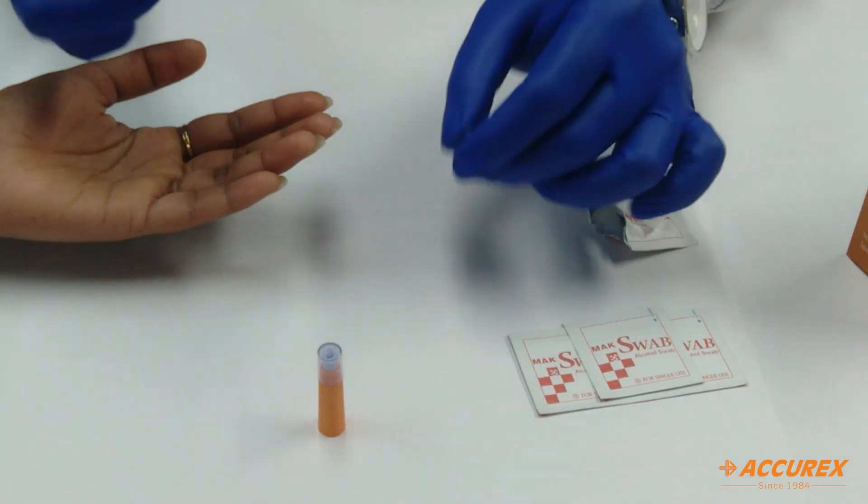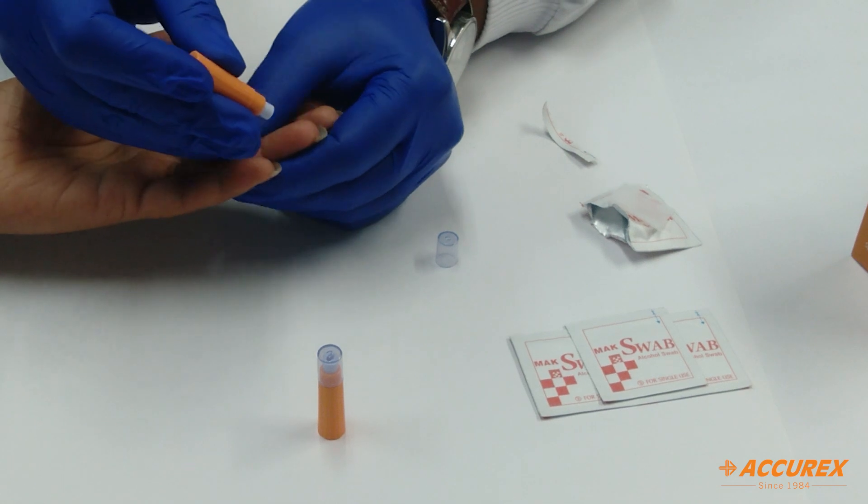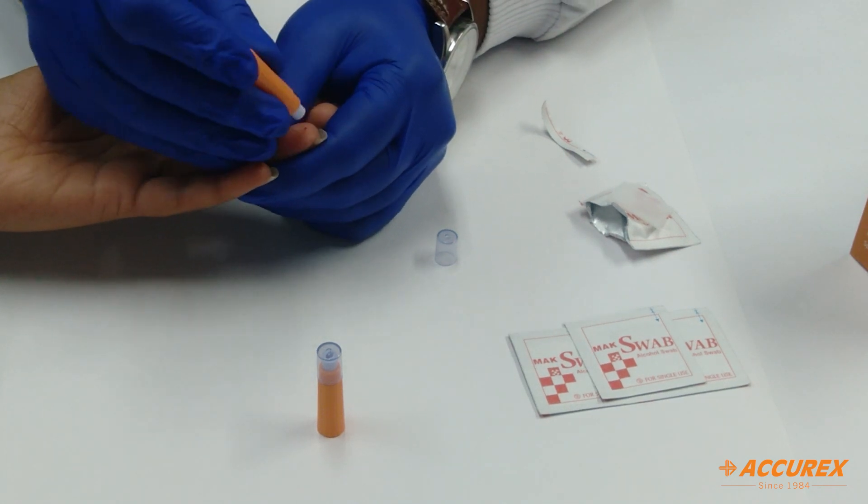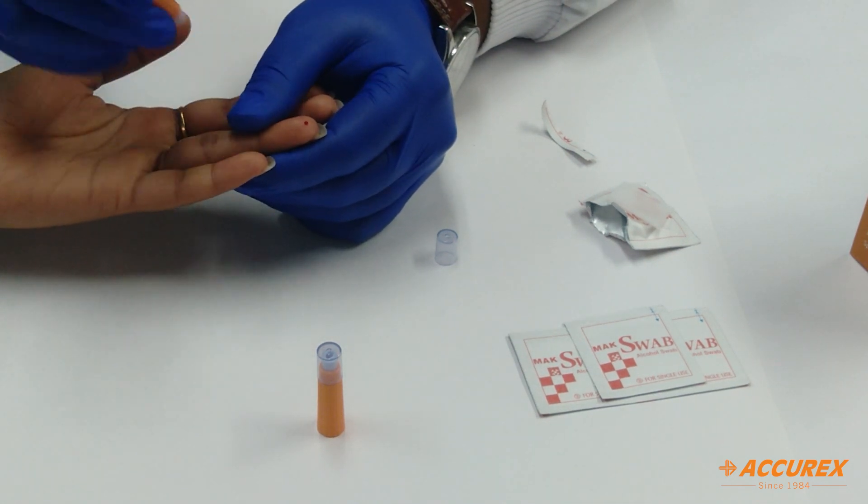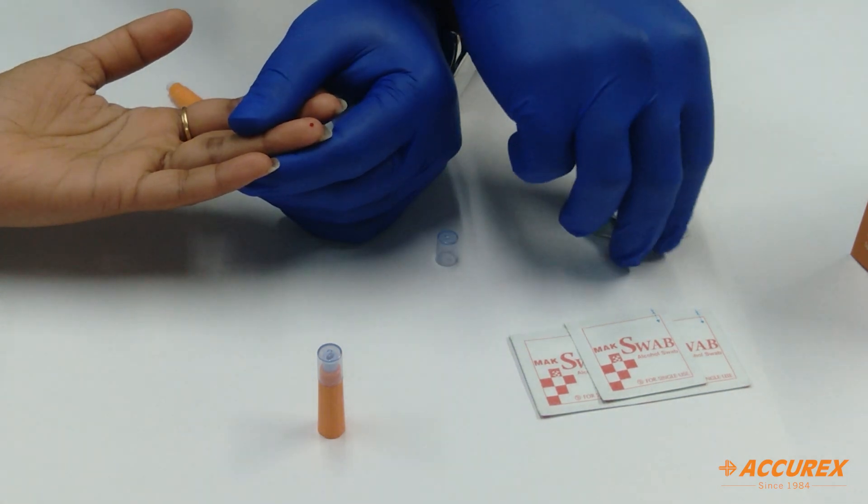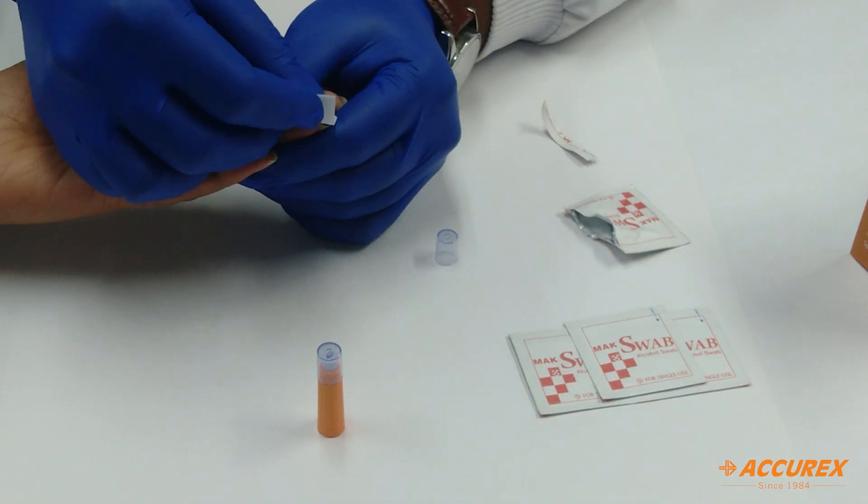Then we will take this lancet. Just tap on this. You just need to prick once and the blood will come. After doing the testing, just wipe out with the alcohol swab.